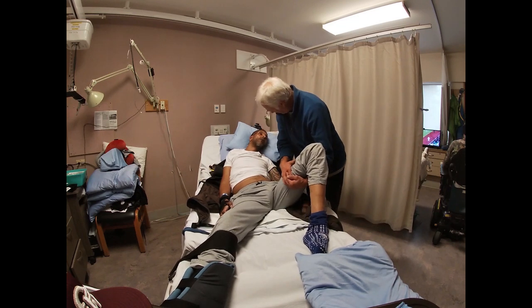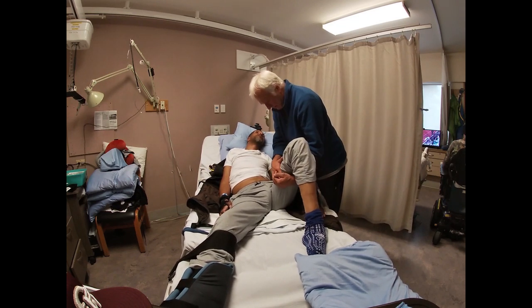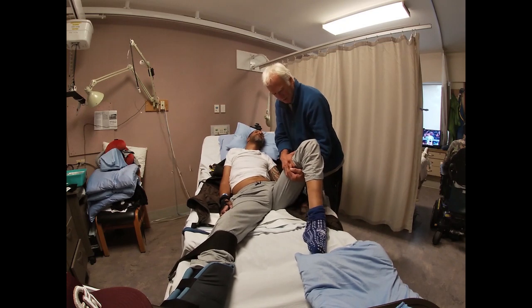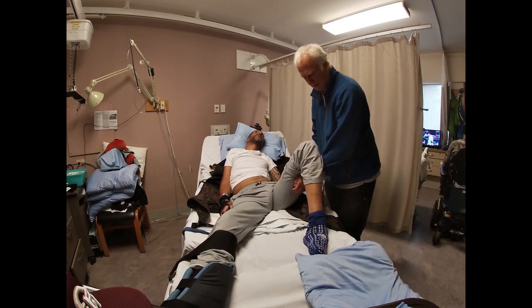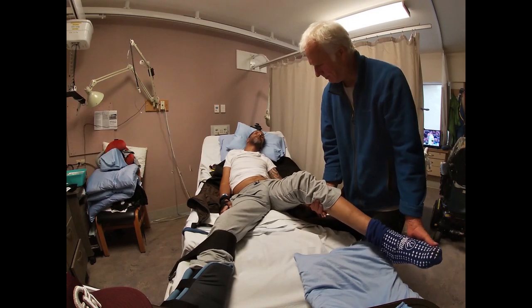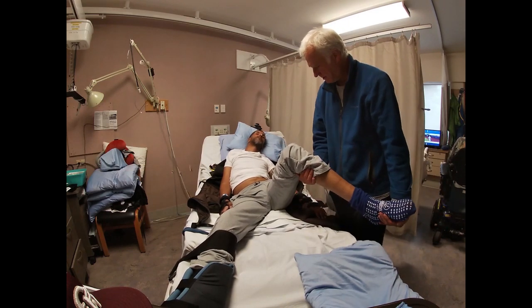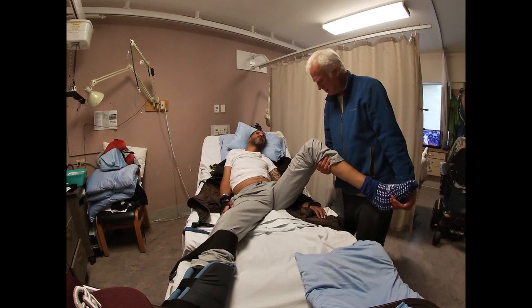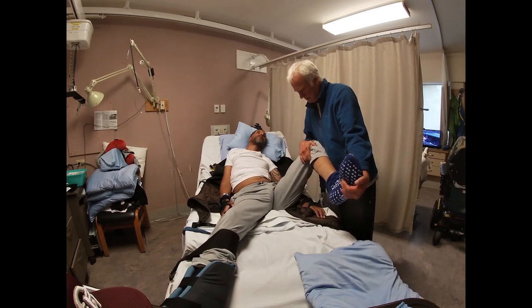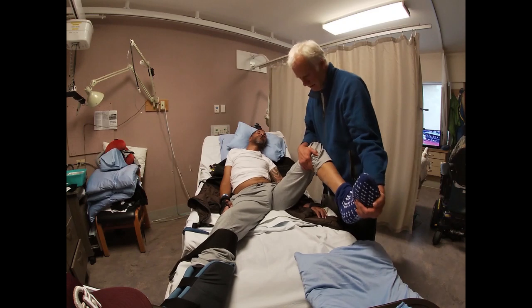Hey Corey, you asleep? No? Just resting? Yeah? Okay. Notice how much tension there was before with the spasm. Still a bit there. And a lot less. I just feel it is a lot less.